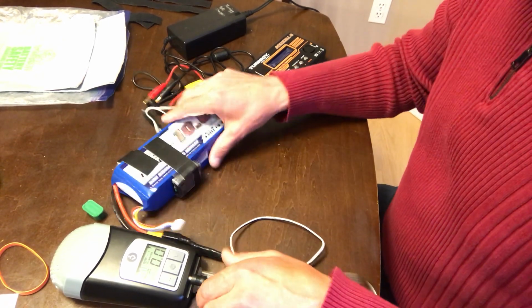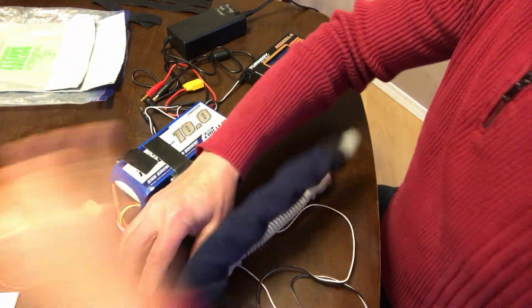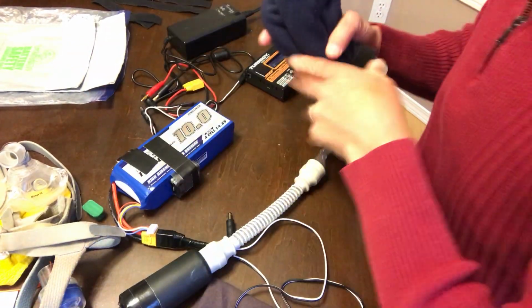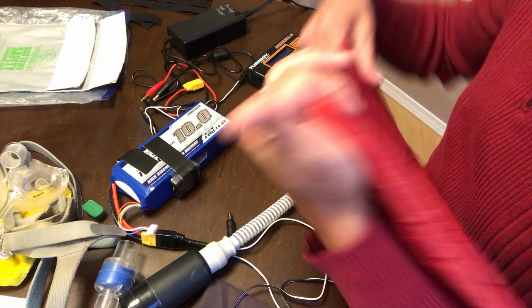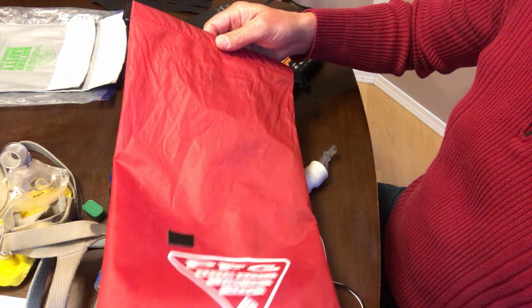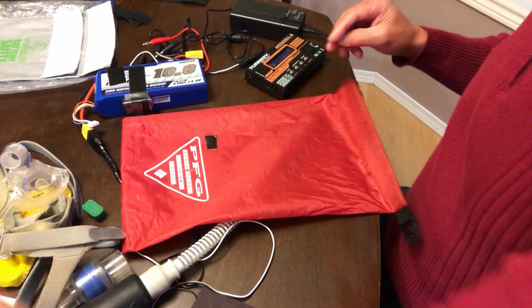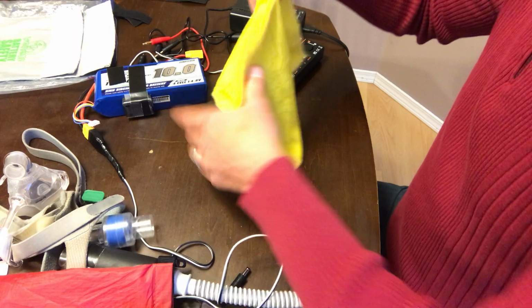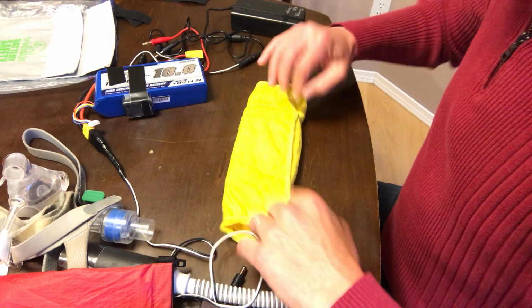Okay, so now let's pack all this stuff up, and I'll show you how nice and neatly it will pack up, undoing everything here. So I had a little system, and so the hose would pack up. So I grabbed this Columbia, this little, I think it's a 10 or 5 liter or something, but it's quite small. And so first we'll put our, actually, you know what I'm going to do first? I'm going to show you what I would do to protect my charger. So this charger had buttons and things, so I thought maybe I would protect those.